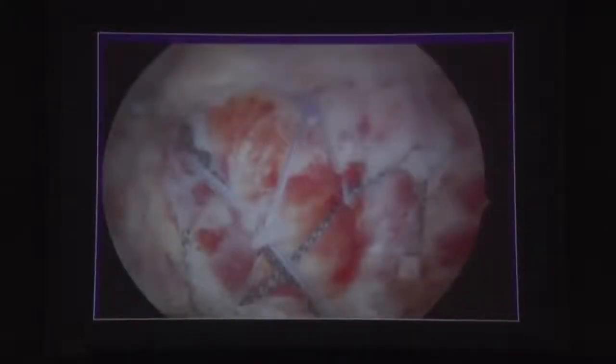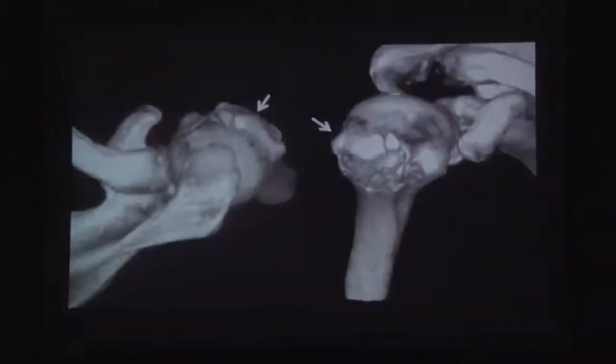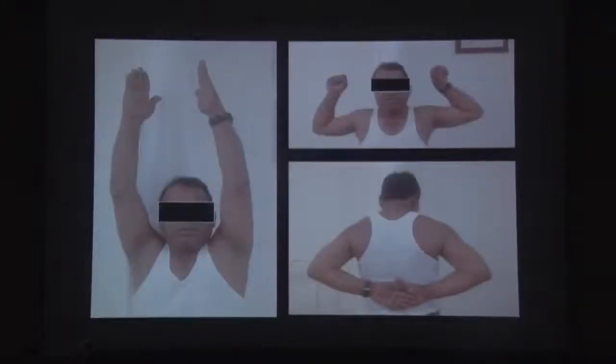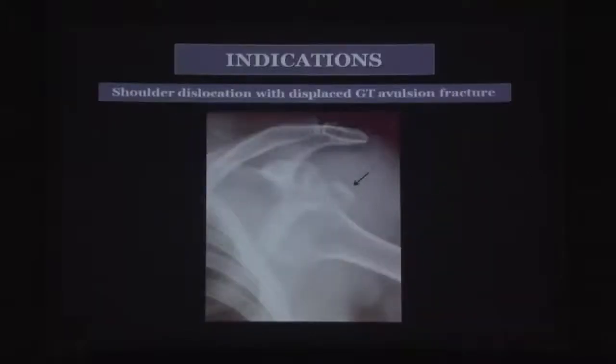Each suture is tightened individually under vision so the fragment sits down in the crater without being comminuted, since nothing passes through it. You can see the fragment sitting in place — the bio anchor, the suture going into the lateral anchor, and the piece sitting anatomically. A screw would often depress and compress that piece, whereas on CT scan you can see this technique results in union and a good functional result.